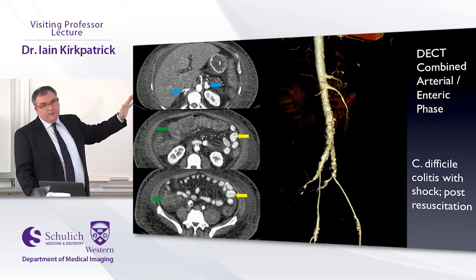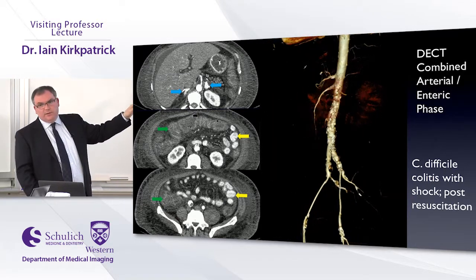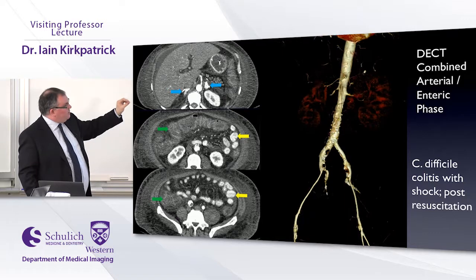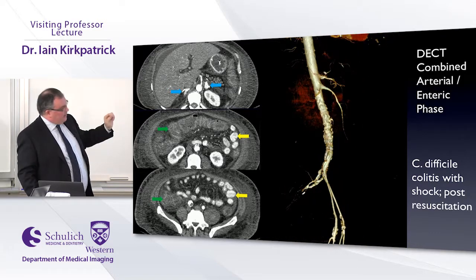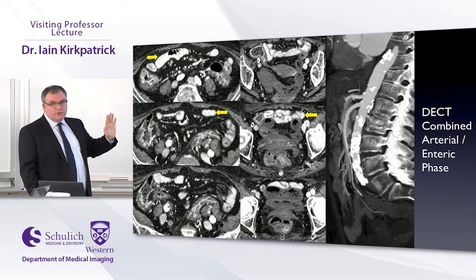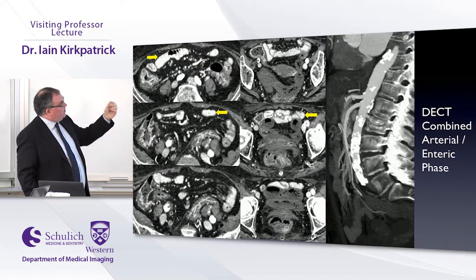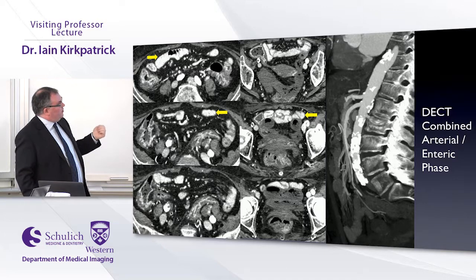And this patient didn't have anything for oral. We didn't give them water. We definitely didn't give them positive oral contrast. That's just the iodine in the bowel wall making them look like that. So you can make them look really bright. And another patient here where you can see that the small bowel is super enhancing. That, again, no oral contrast. That's all the bowel wall that's enhancing. It's just relatively non-distended, so it almost looks like there's oral contrast in it.